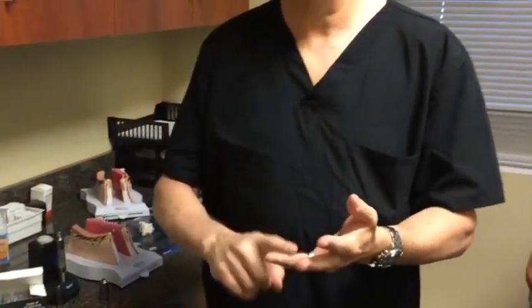So just to review, let's talk about some do's and don'ts. First of all, make sure you soak your tips long enough, and that's your very first step. When you're doing the treatment, make sure you treat long enough. Many first-time users will get in and start using a BlephEx. They think they've been there for 30 seconds and they've only been there for 10 seconds, because it's something brand new to them and everybody's a little bit nervous when they first start. So treat long enough. You can't treat too long. More treatment's better than less treatment, just like more soaking the tips is better than less soaking.